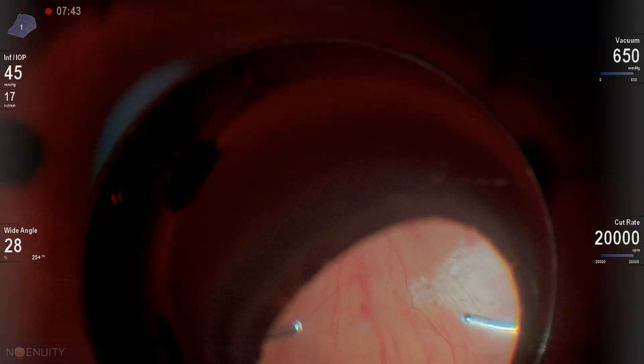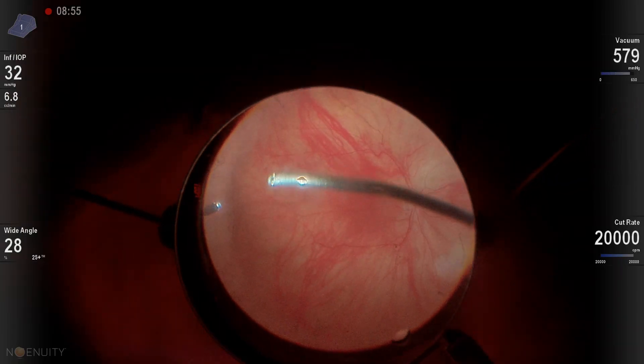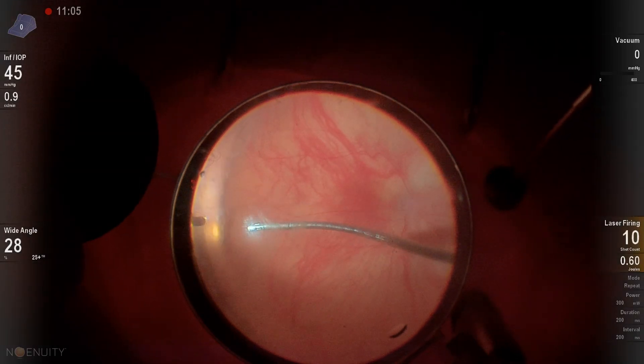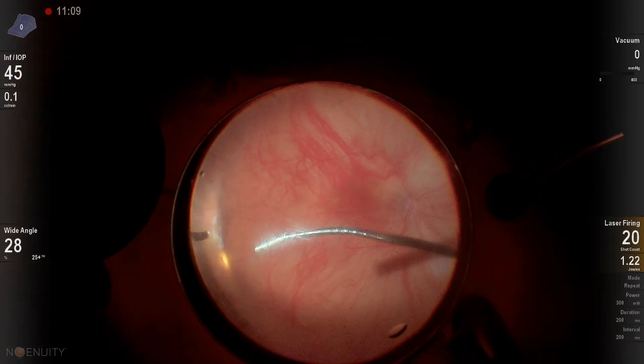A little trickier in a phakic eye as well. Then core vitrectomy. We're just going around now and kind of looking to see if there is any vitreous left. We're also trying to remove any floating oil bubbles or remnants of any PFO that might've been left behind.